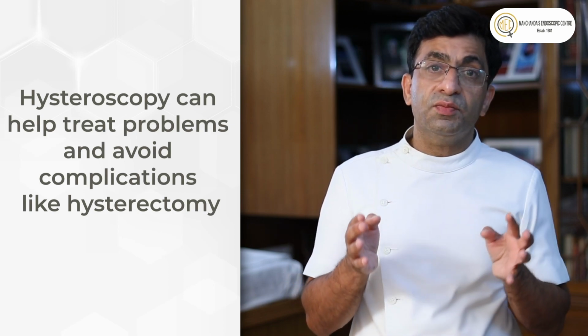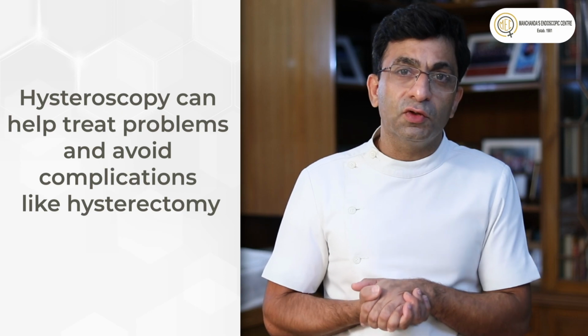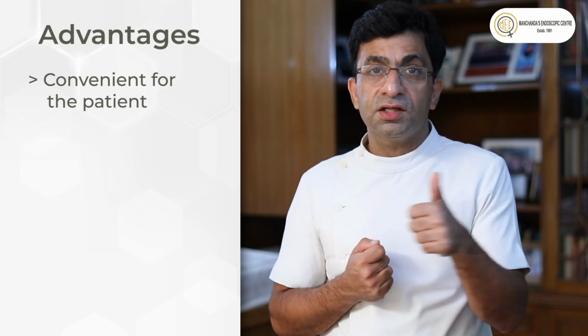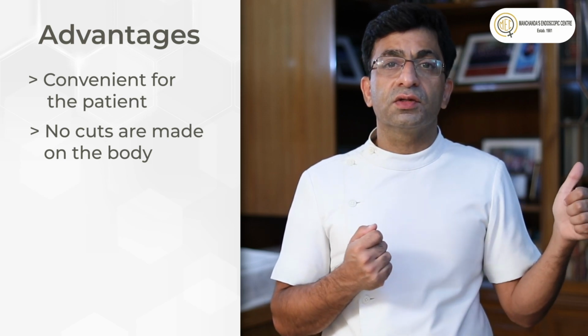It can actually diagnose and treat problems to avoid many uterus removal, or what we call hysterectomy, procedures. So it's much nicer for the patient. You don't need to get larger surgeries done. There are literally no cuts on the body.